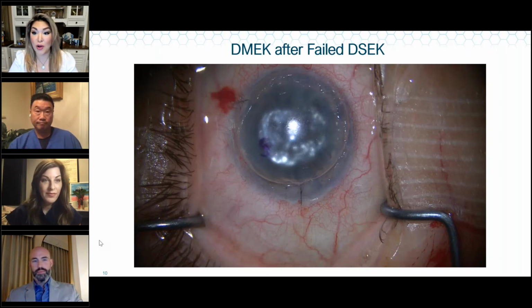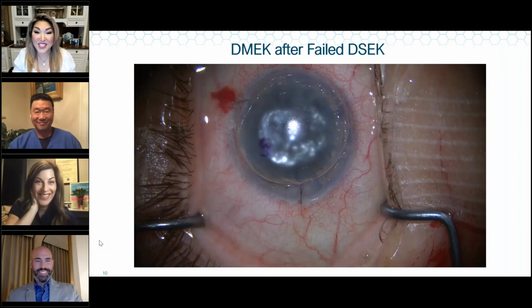Okay, so I'm not being rogue, like cowboy style, because I know a lot of surgeons who are still very particular about looking at them at the slit lamp. I used to bring a portable slit lamp. I had like a little kit. I mean, we did everything, right? Just to make sure. But it's become routine, and you realize that they do really well because we leave their pressures a little bit lower at the end and such.